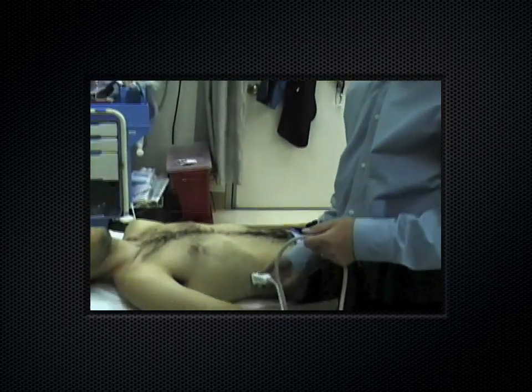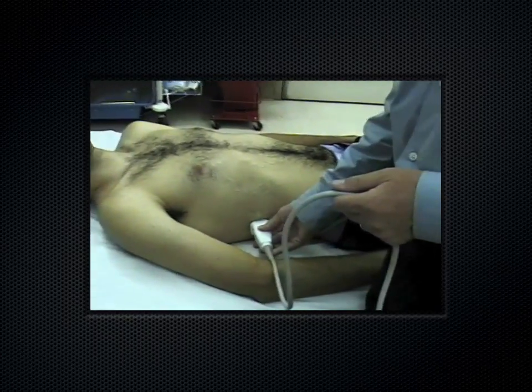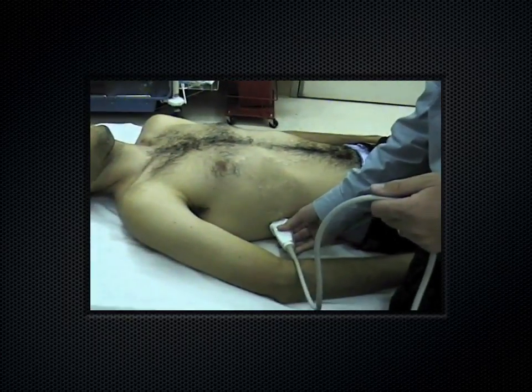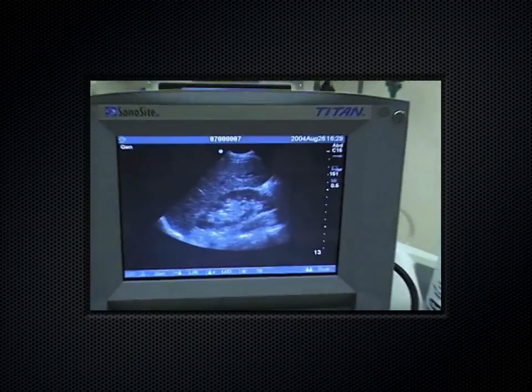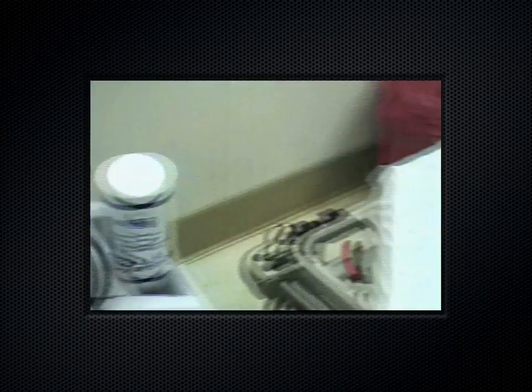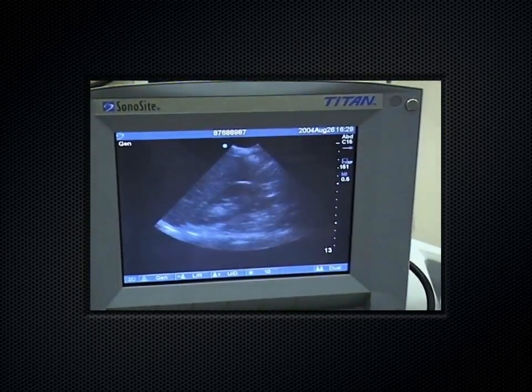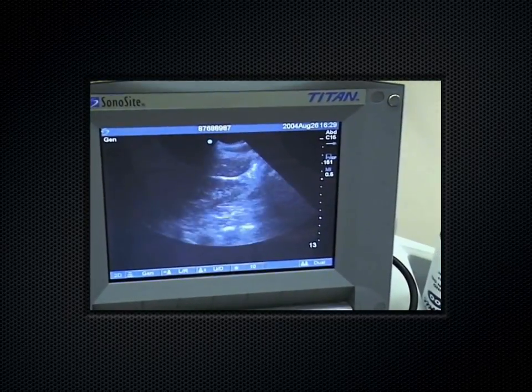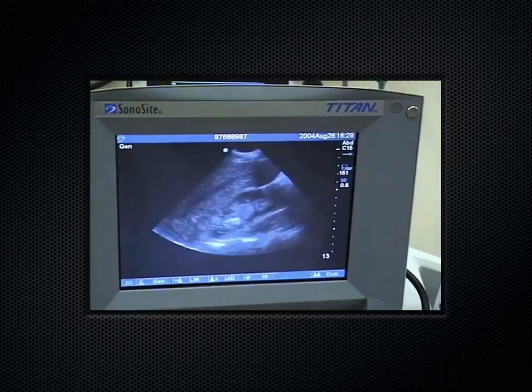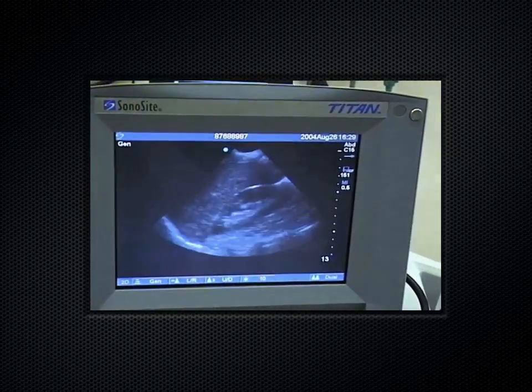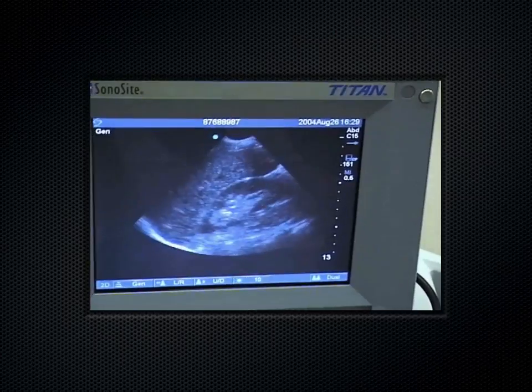For the renal scan, you get a nice coronal view of the kidney — you can get the upper and lower pole on screen at the same time in long axis. Rotating the probe 90 degrees gives you a short axis. You always want to fan through an organ in both its long and short axis — that applies to the gallbladder too.